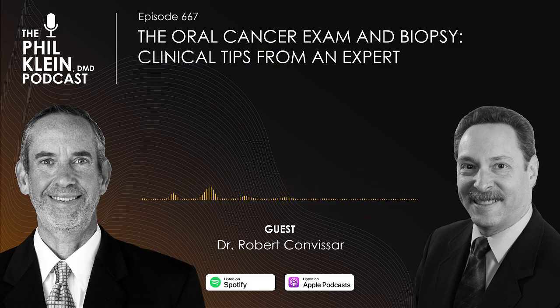And these things are invaluable. And it's not just from the point of view of dentists thinking it's invaluable. The Journal of the American Medical Association published an article not too long ago about how invaluable these are for use in surgery. That when somebody comes in with a lesion, the goggles and other similar devices are able to delineate the margins of the lesion much, much better than if you just use your own eyeballs. These things are really invaluable.